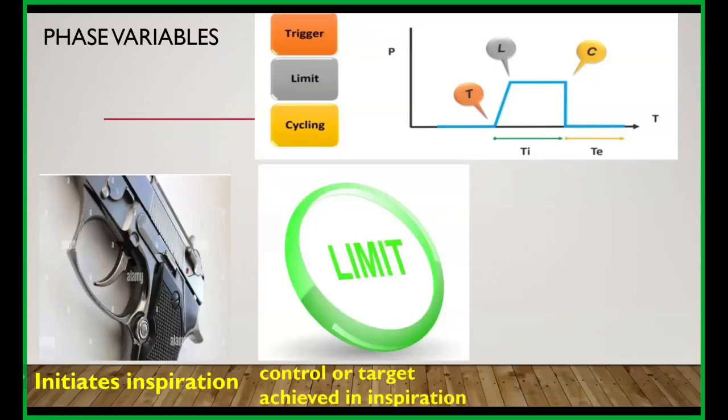For example, in pressure limit, if the limit is pressure, and you set, say, 25 or 15, that limit has to be achieved by your volume. That is the idea of the limit.